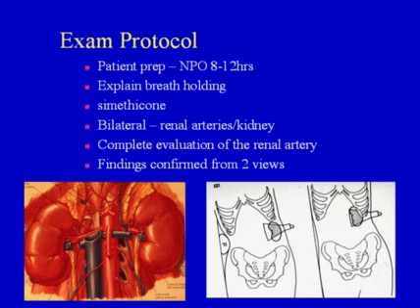When the patient arrives, you should explain the breath holding techniques, because it's critical that when you need the patient to hold their breath, when you find a stenosis, they don't take too big of a breath and completely move the vessel out of your field of view. Simethicone does not get rid of large amounts of gas, but simethicone might be able to help with small pockets of gas that come in once you've started the exam. There's no contraindication to simethicone, so it is safe.